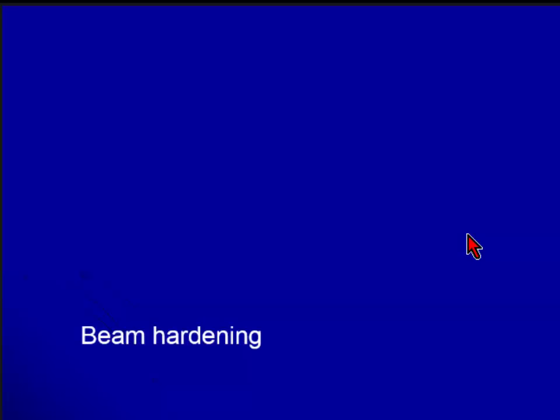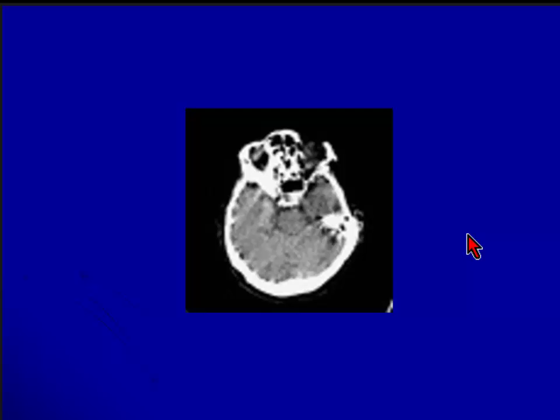Tube artifacts make images uninterpretable — you can't define the morphology or see any lesion, so you need to repeat the scan. Beam hardening from the petrous temporal bone and thick bones such as the sphenoid creates streak lines. If you are looking for a brain lesion in that area, it becomes very difficult because brain tumors or metastases appear as low density on CT, while blood is high density.